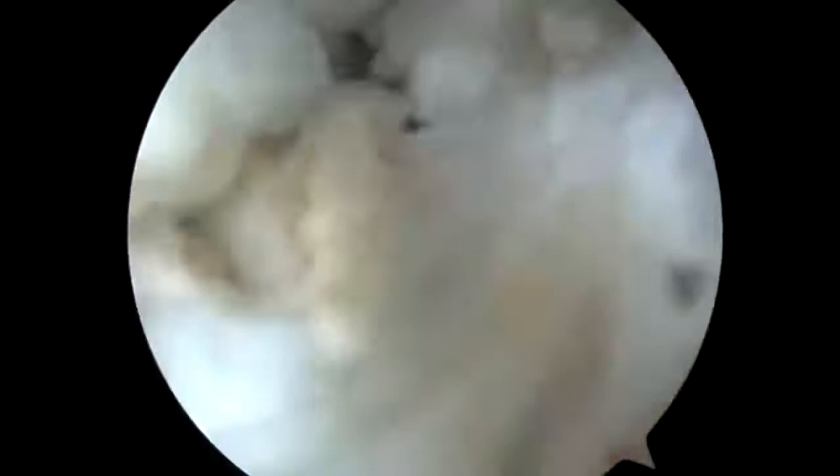Now I'm in the back of the shoulder on the other side. I'm just taking the biter, coming up and cutting all that thick capsule. That's supposed to be tissue paper thin in the back. You can see it's not — it's very thick and I have to cut through with the biter.